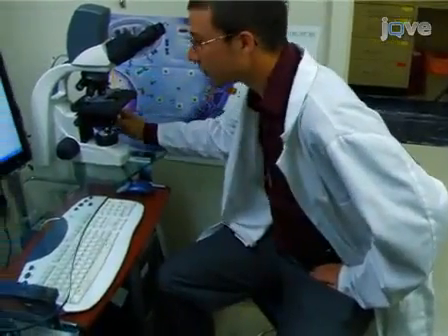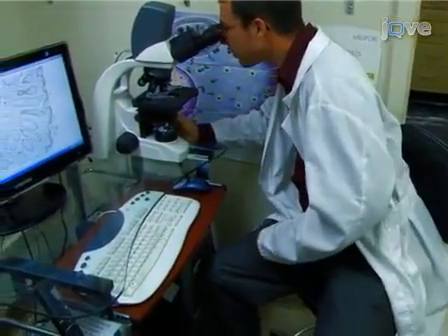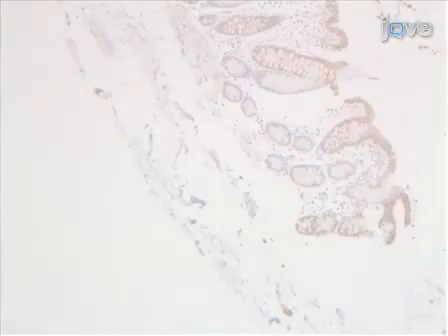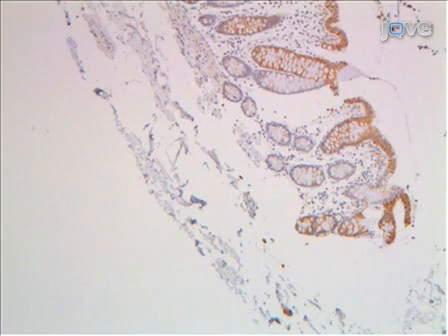On this slide, Alex Fasista will go through an entire tissue section obtained near a colon cancer and immunostained for CcOI. We are now looking at a tissue section taken 1 centimeter away from a colon cancer, immunostained for CcOI. With a 10x objective lens, we can observe a crypt with high expression of CcOI, as well as a cluster of crypts with low levels of expression of CcOI.